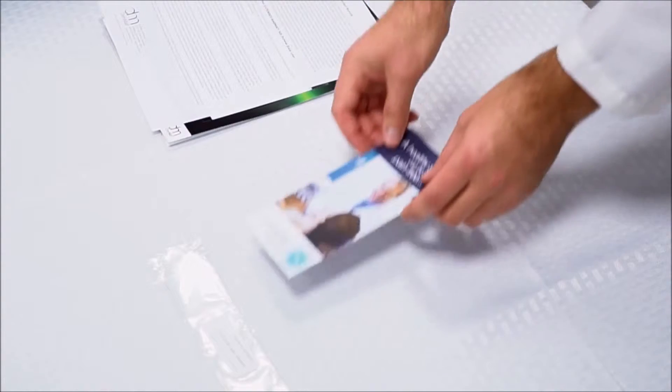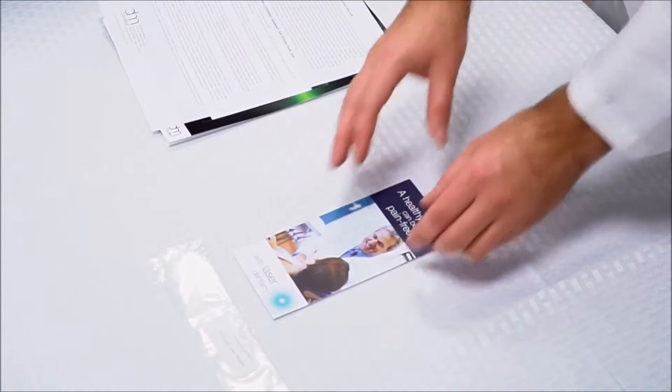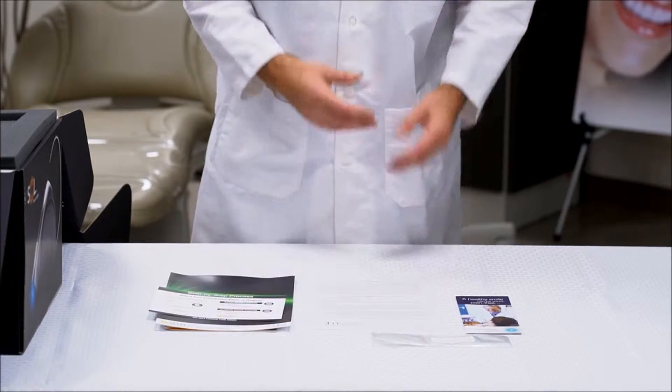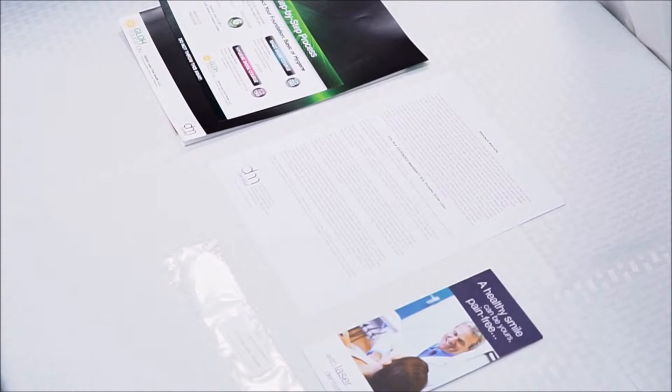You also see a patient guide. This can help you explain laser dentistry to some of your patients. Next, you have your warranty card. This goes over some important warranty information, so please look over this carefully.